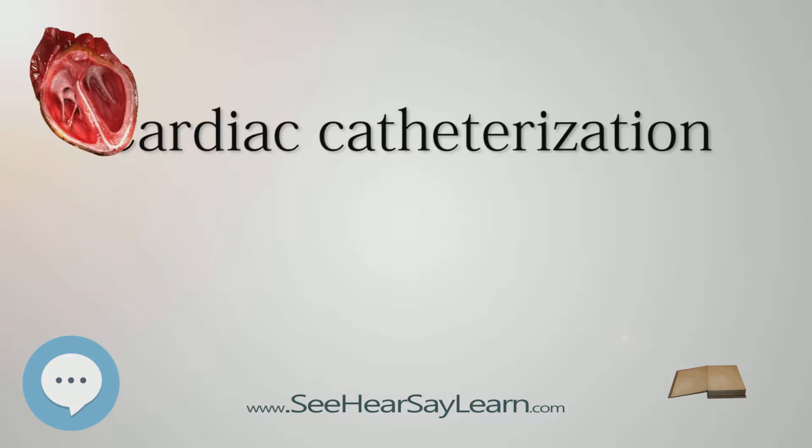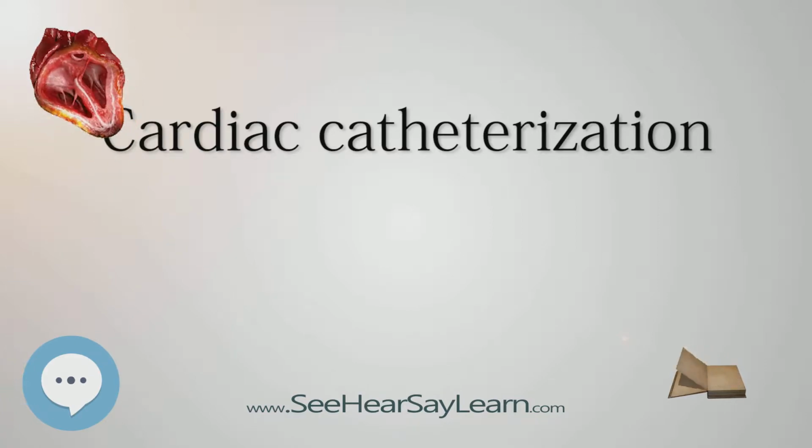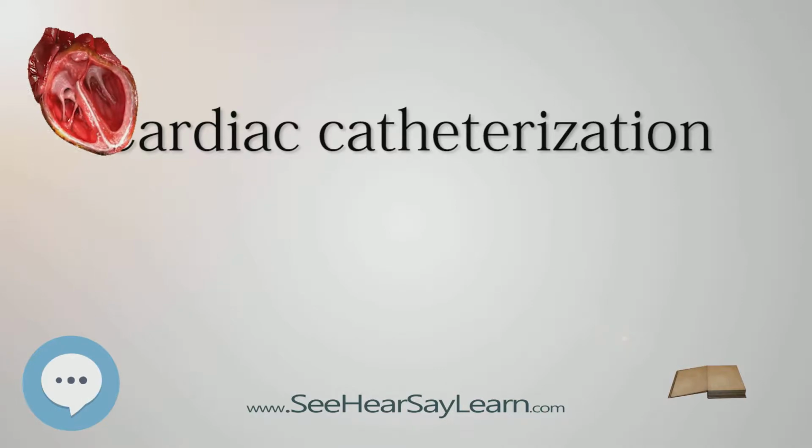For example, coronary angiography is a diagnostic procedure that allows the interventional cardiologist to visualize the coronary vessels. Percutaneous coronary intervention, however, involves the use of mechanical stents to increase blood flow to previously blocked, or occluded, vessels.